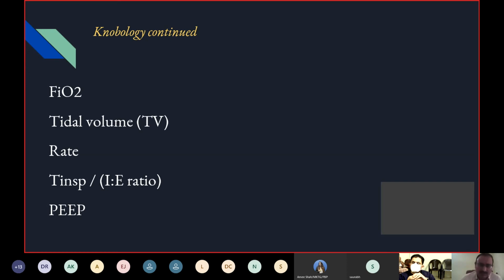Why should I think like that? The reason I'm thinking like that is your vocal cords are maximally apart when you inspire and partially closed when you expire. So that partial closure, theoretically, probably produces a PEEP. But practically, they've tried to assess all the volumes and things like that and haven't really found evidence behind it. But theoretically, once you put the tube between the vocal cords, you have taken away that effect of partial closure. So I am actually a fan of PEEP, I should say that.